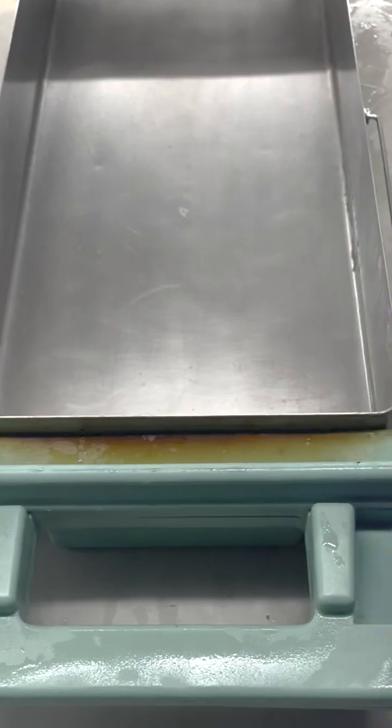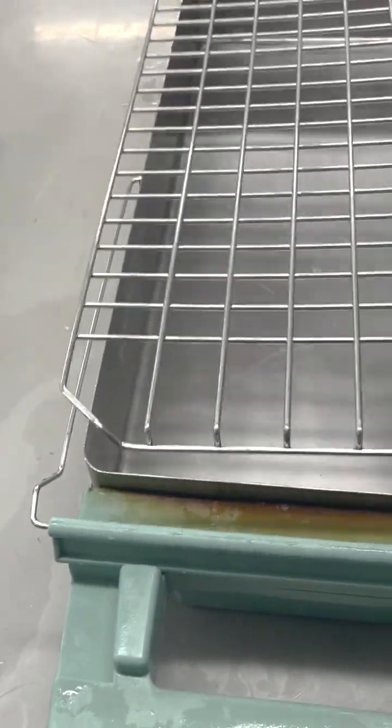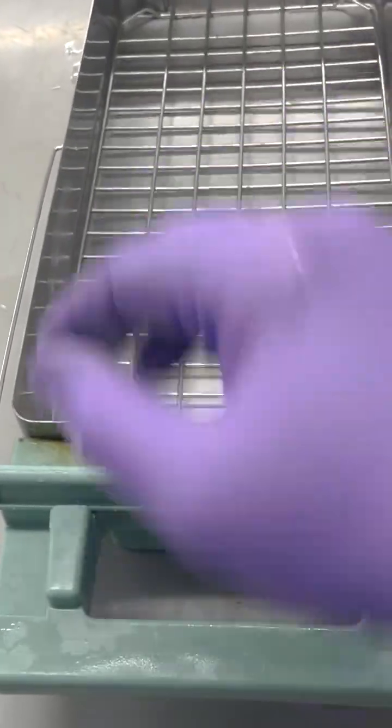You can take a damp wet cloth and wipe these down afterwards. Once you rinse it nice and clean, just repeat the same step on your lid there and you're good to go. Thank you.